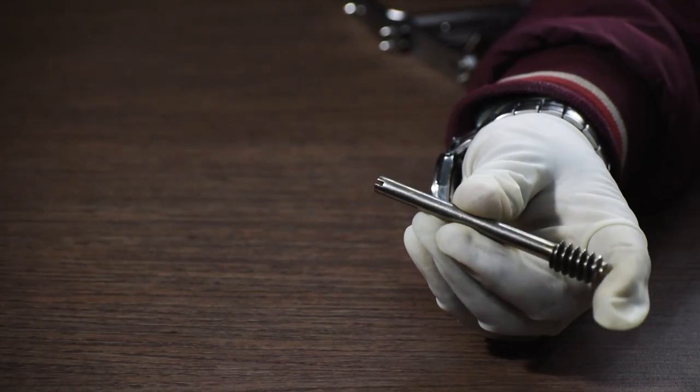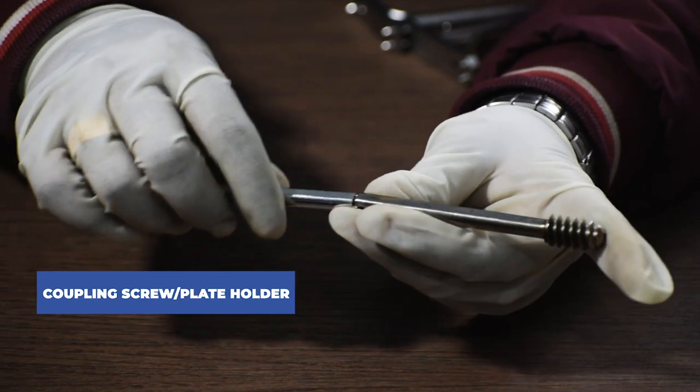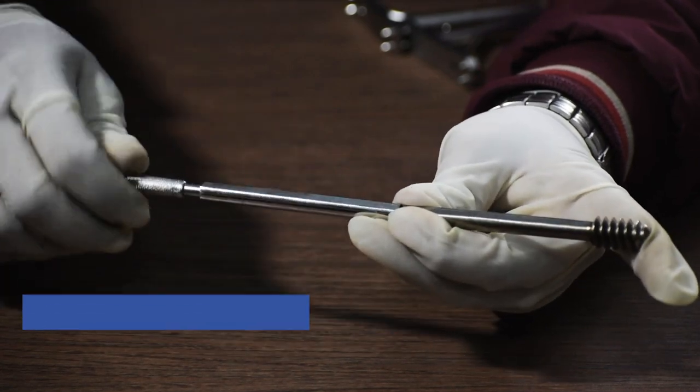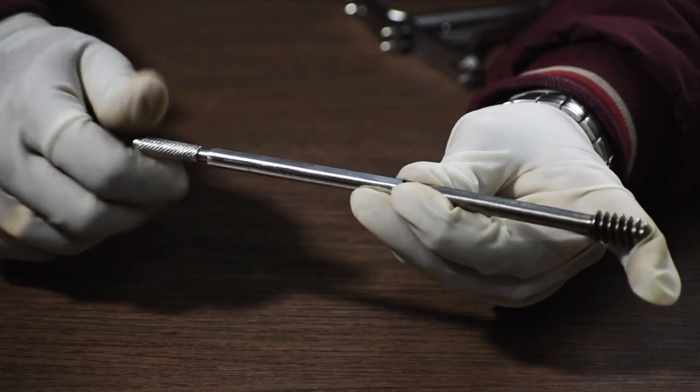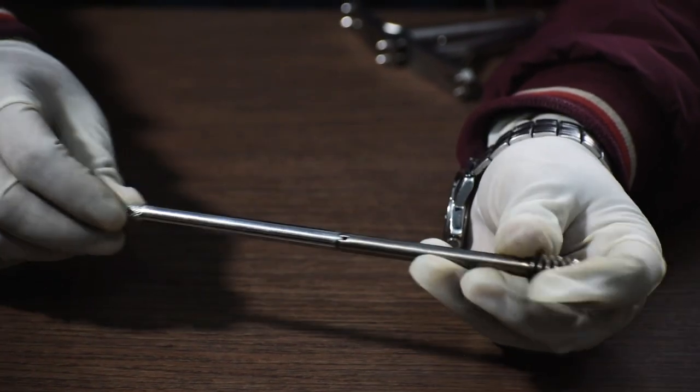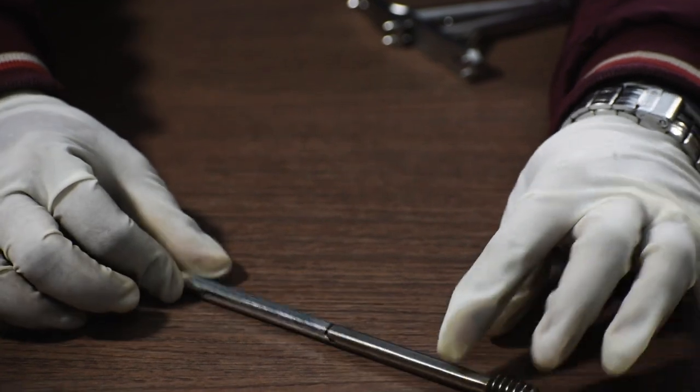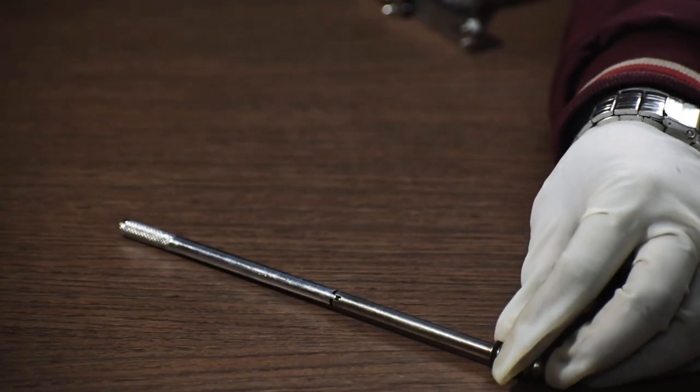Now in order to fix a DHS plate, that is a dynamic hip screw plate, we will attach the plate holder or the coupling screw in this end of the lag screw. Now remember the guide wire is still present and all these attachments and implants are placed and attached with the help of the guide wire passing through these implants.